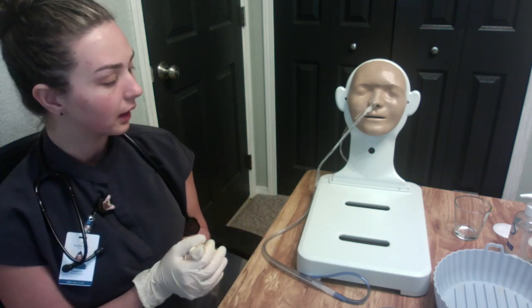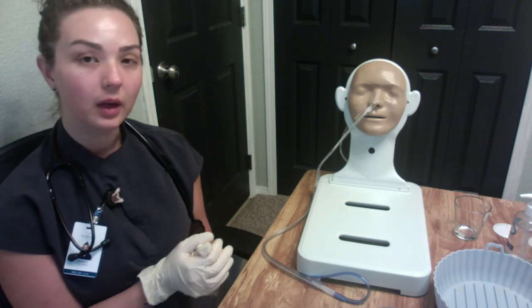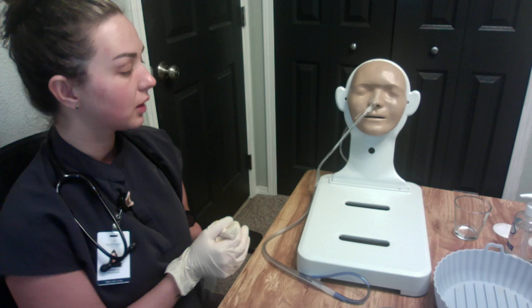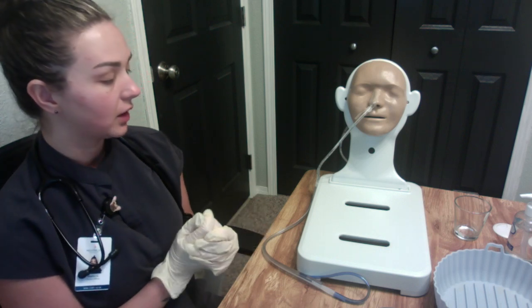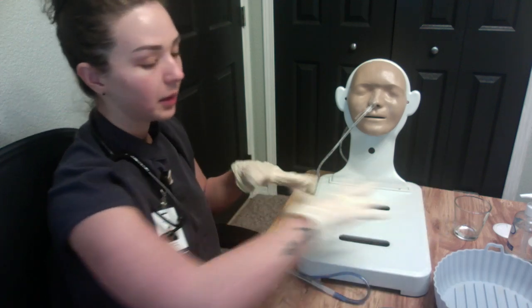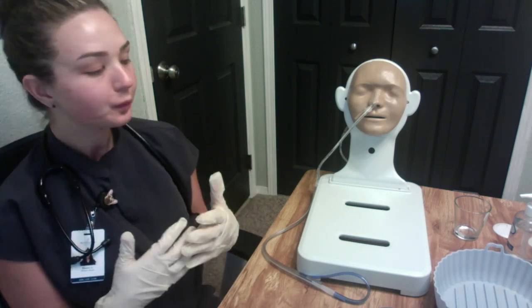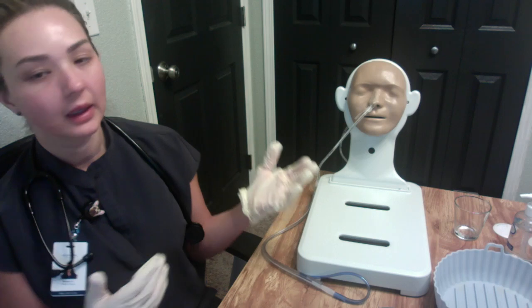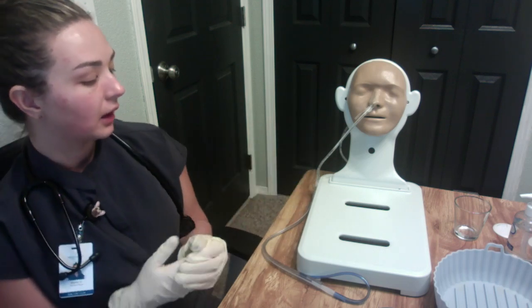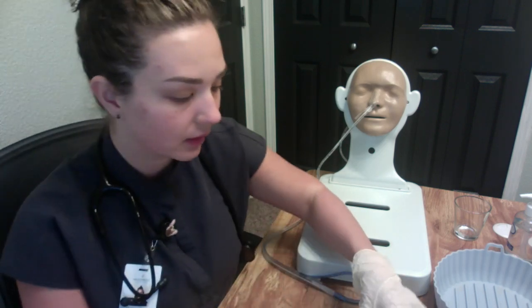You know what I just realized? I don't have a towel to cover up my patient. So ideally, in this procedure, we would want to put a towel across the patient to prevent any kind of mess and to keep them dry. If suctioning was applied, we would definitely want to maintain patency. Now, wrapping this up, we would definitely want to clean this stuff up.